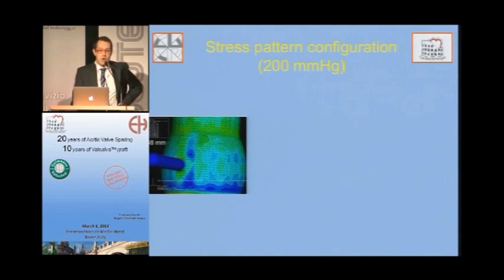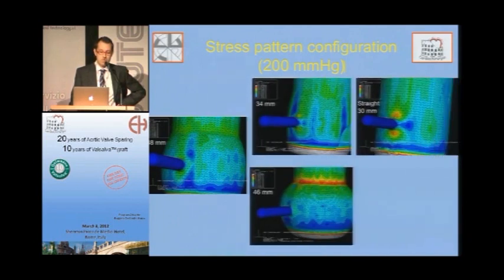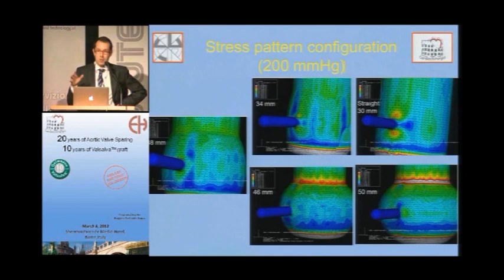When put under stress at 200 millimeters of pressure, we obtained these patterns, which somehow resemble what Marco showed us in the last slide.